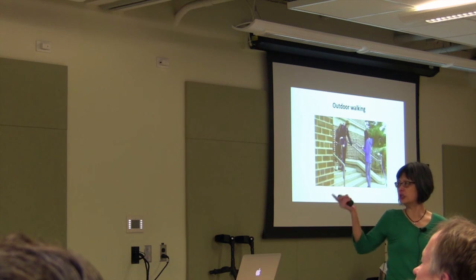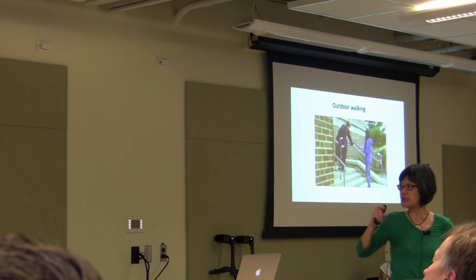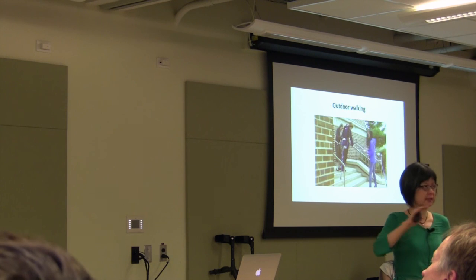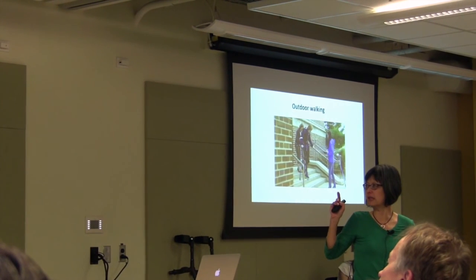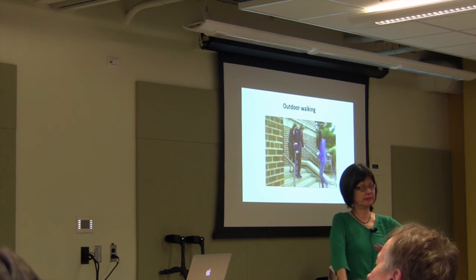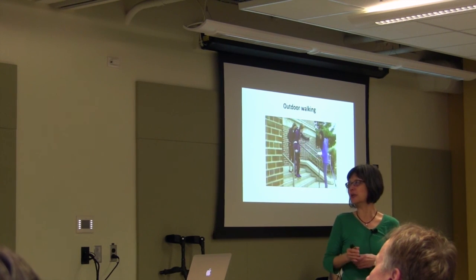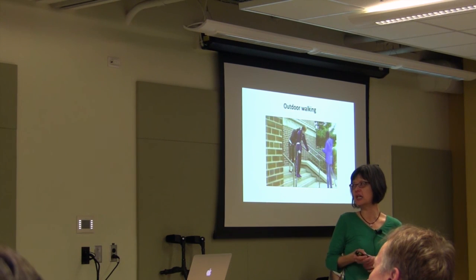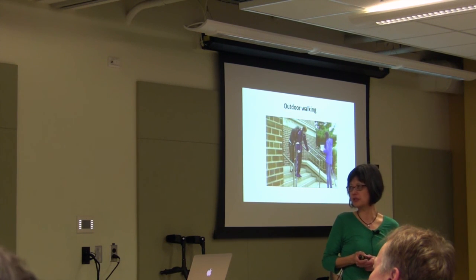And then you'll see her coming down, and she adjusts the strap because you need to lean forwards a bit. And again, as she comes down, you push the button for every step, and it's a little bit precarious. If you look carefully at how the foot lands, she controls where it lands. The machine just goes. So it takes quite a bit of learning and finesse, and it's not super easy on those stairs.